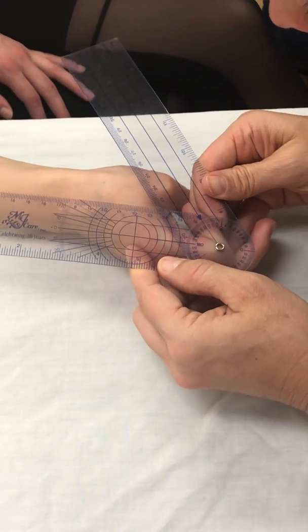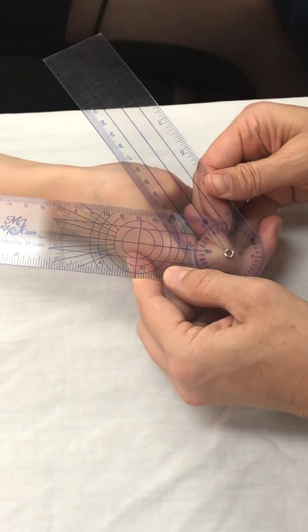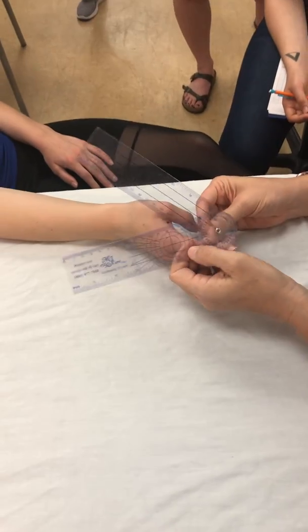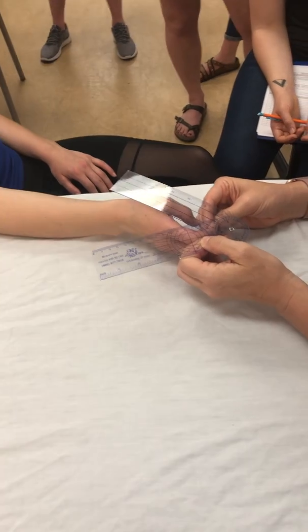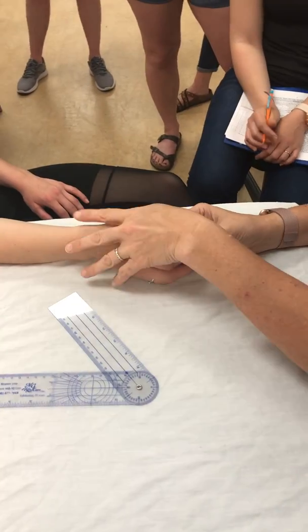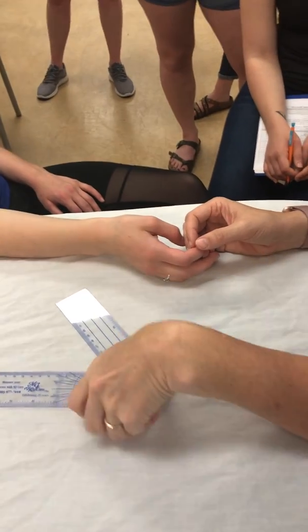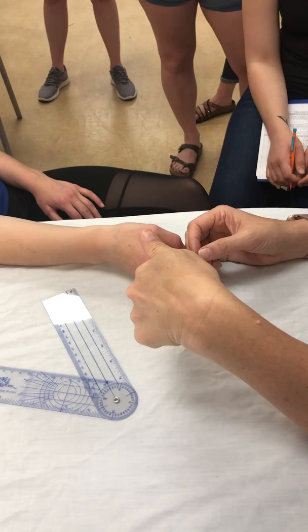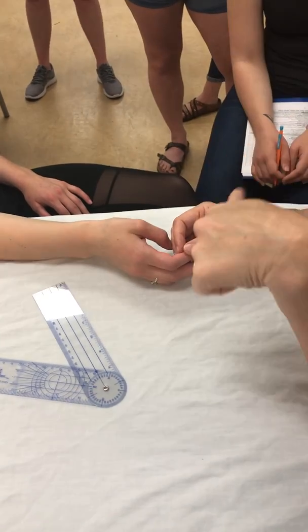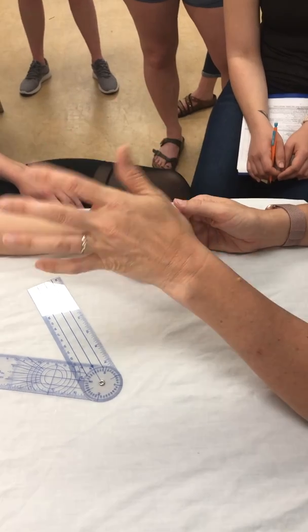Look at you, show off. There's a lot of motion. And I'm weak. Okay, and then I could do the DIP as well. Okay, it's the same logic. Just think about where it gets confusing with the thumb is like, well, what side do I put it on? If you just think about the axis always has to be perpendicular to the movement, and if you think about the movement happening around that pin you put in there, that maybe will help you, okay?